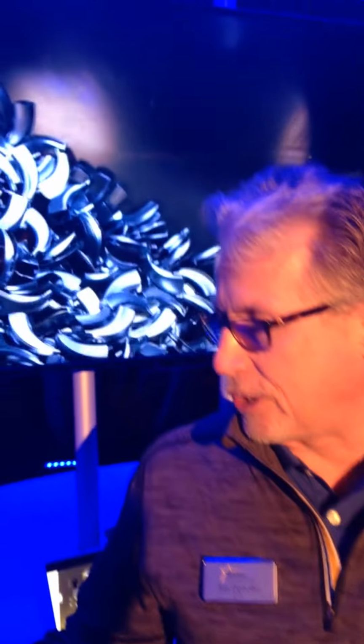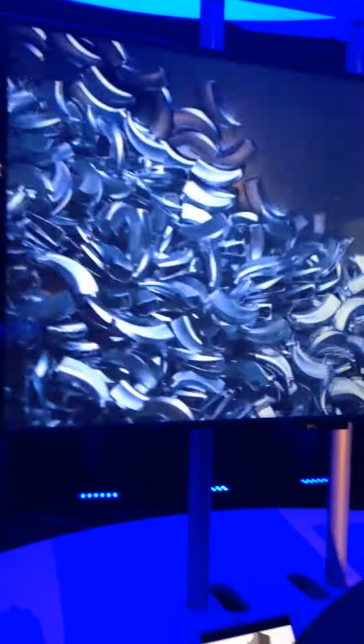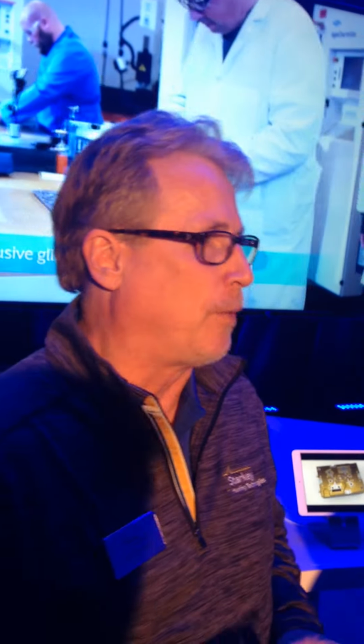The tool room is where we build, repair, and maintain the injection molds that are used to mold the plastic components. There are 13 tool makers and machinists in this group, and they support close to 1,000 injection molds. A typical Starkey RIC or BTE each contains an average of 10 plastic parts, and each part requires its own injection mold. So the total cost for tooling that'll go into a BTE or a RIC can exceed $600,000.